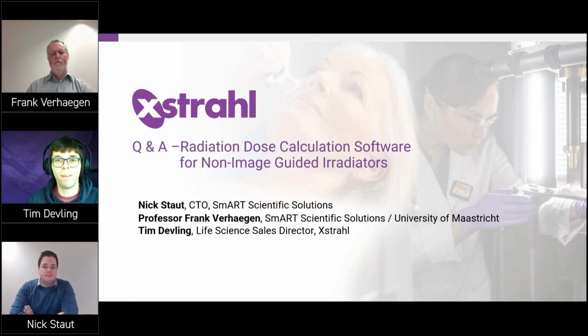So now we're getting into the devil in the detail. You might guess who some of these questions are coming from, but which detectors were used for the PDD measurements in the different materials? EBT3 film. So film-based. Yeah. And we also had the ion chamber measurements for the air kerma, obviously. Okay, and what solid water did you use? Plastic water LR was the solid water, and the bone material was RB2.